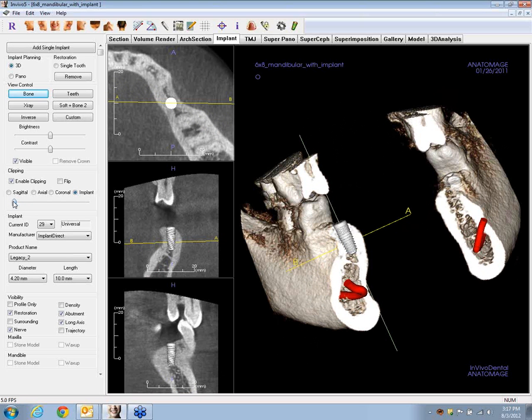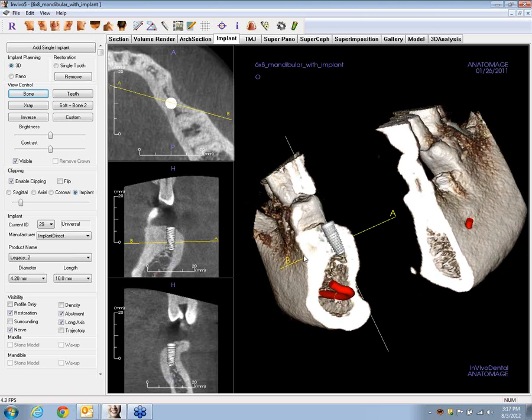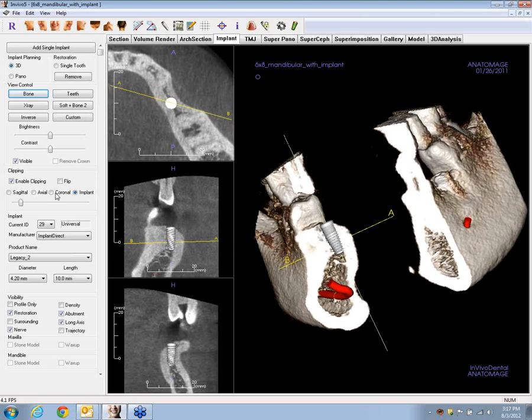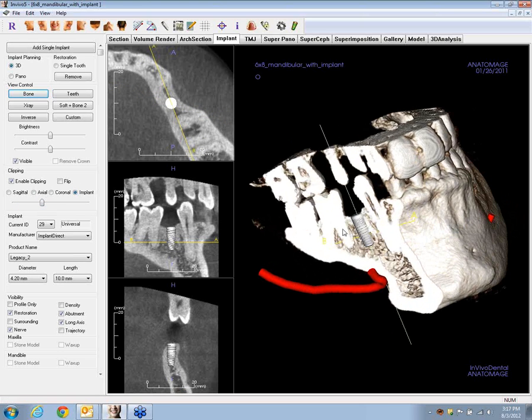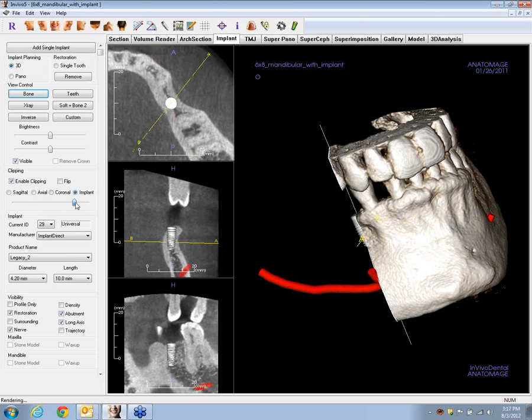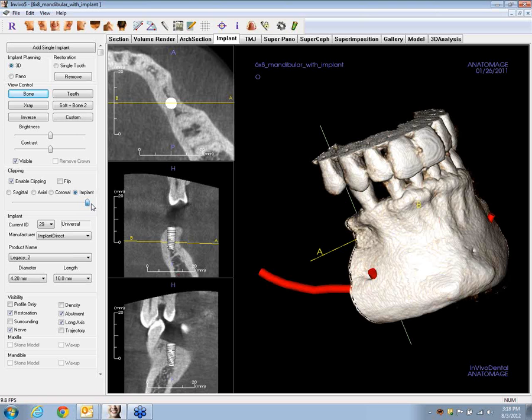All right, so we can see that we've got a pretty fair amount of cortical bone that we're going into, but it's not awfully stout down here in the bottom. But it looks like the implant that we're using might get pretty good, strong integration once it's in there. And we have avoided perforating our buccal plate with this now. So we come around and see that that bone wraps around.